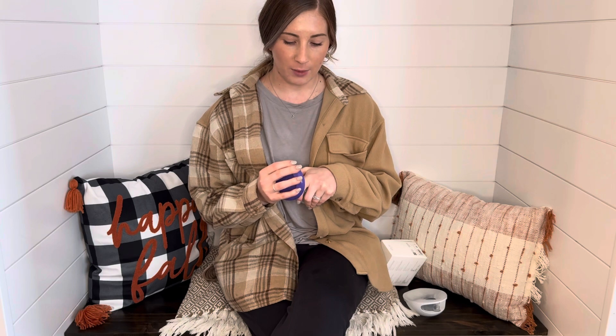So the first thing I want to do is talk about the Haakaa. This Haakaa retails for about $13.99 or $14.99 on Amazon. You can get it at Target, pretty much anywhere baby stuff or nursing stuff is sold. It does come with a lanyard as well — it's very convenient.